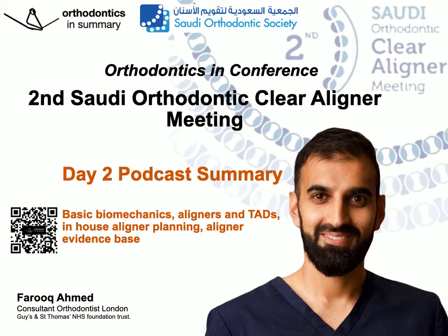He described the accuracy of tooth movements. In horizontal plane, we are reasonably predictable with aligners, and that was Chara Lampakas in 2018. But for rotational and vertical movements, we are relatively unpredictable. With deep bite reduction, we tend to only achieve 1.6 millimeters of correction, and that was by Khosravi in 2017. And most of that correction is through lower incisor proclination.